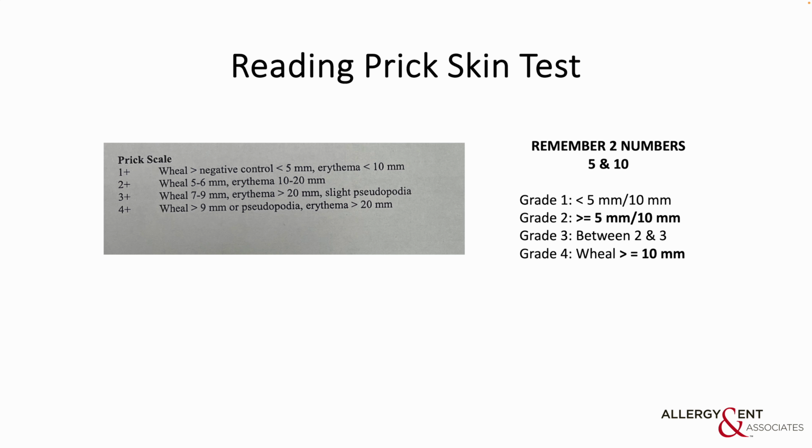So let's talk about how to read the test. Remember this, skin test reading is not easy. Okay, it can be easy, and I will make it easy for you, but it's not easy, especially at the beginning. It requires a tester to pay very close attention to the details at all times. You may have a hard time reading the test at the beginning, but you will get used to it.